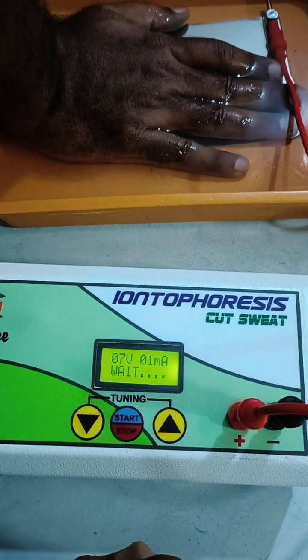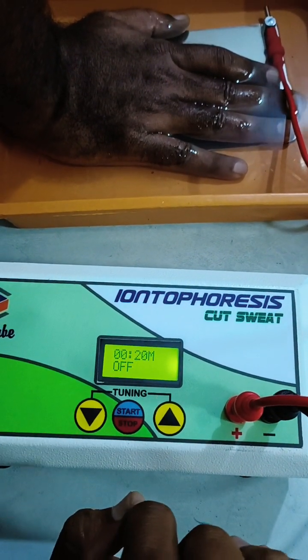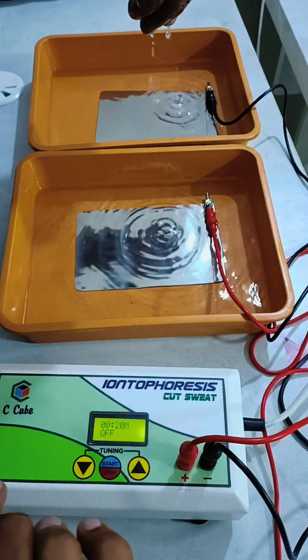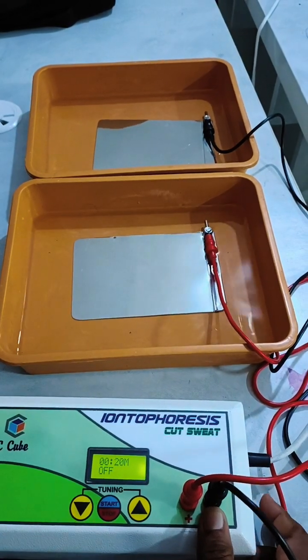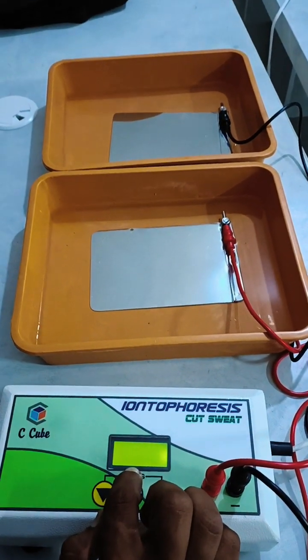Please note: a person with a pacemaker, stent, or any other implant in the body should not use this device. Also, do not place your hand in the tray before the initial CQBadvance Technologies startup screen has finished displaying.